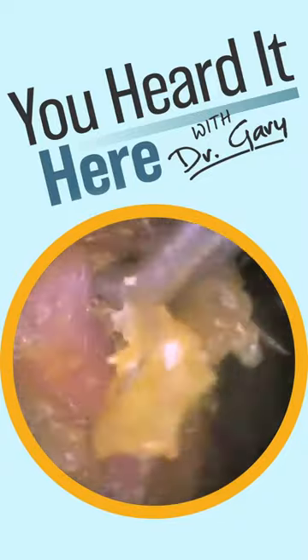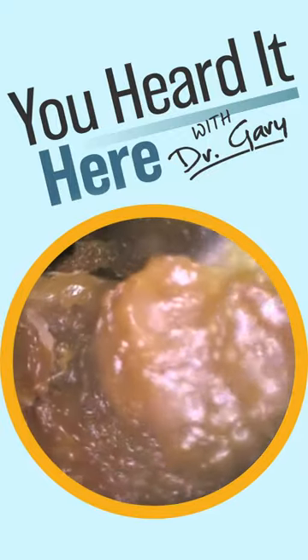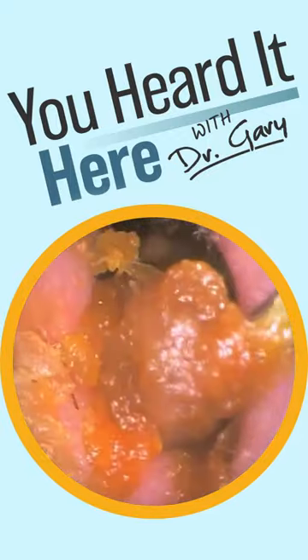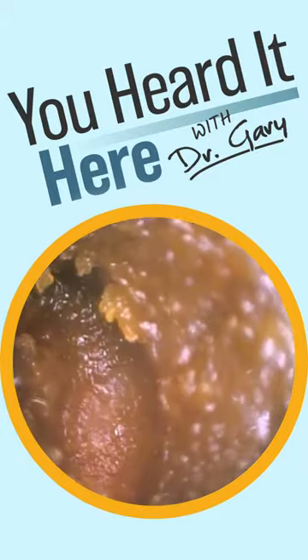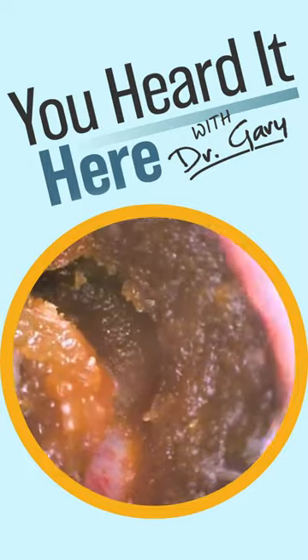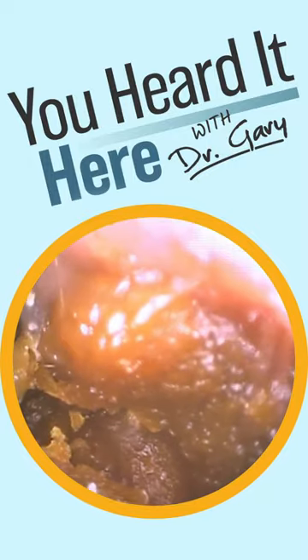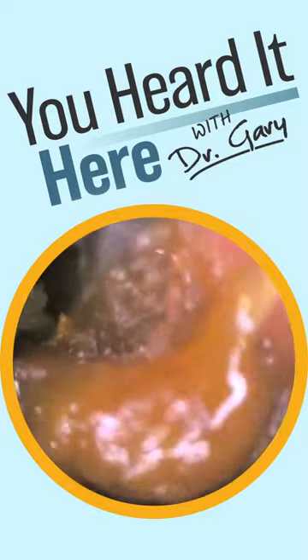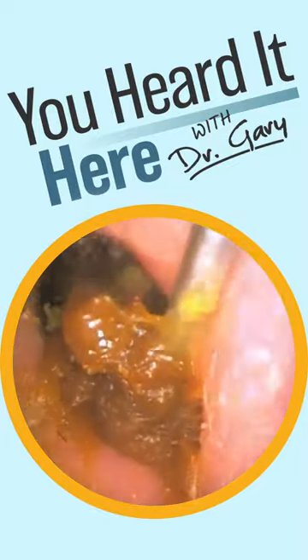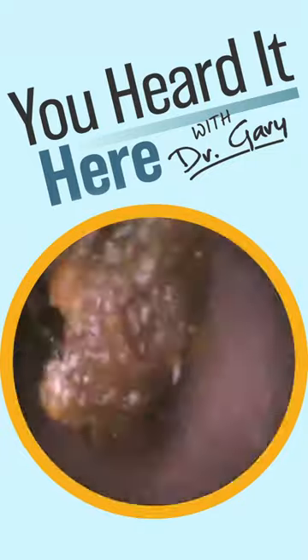You can see here that we're using the curette and it's going directly through that wax. It's not really building large chunks around it and not letting me pull it out in a big piece. This type of earwax removal gets a little bit challenging especially when using manual tools, because we can't get it all to stay together. So our plan is to remove as much as we can from the outside, and then if there's still some down by the eardrum, go ahead and use a little bit of irrigation just to remove that last little bit.